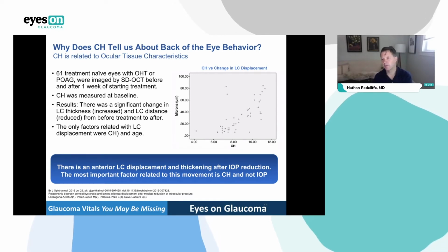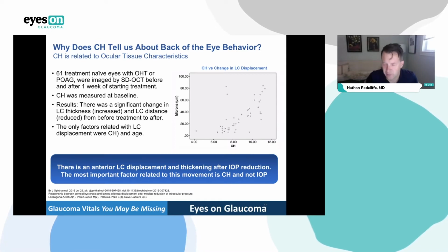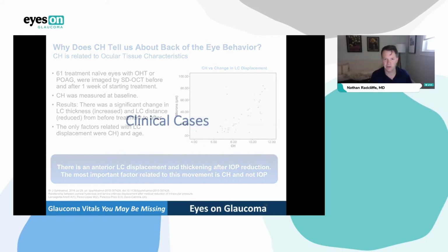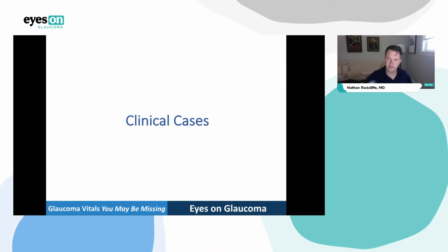And then think about what happens when you get older, you lose your hysteresis, it's now low, the shock absorber isn't working, the pressure goes up, but your hysteresis is low. Instead, the nerve can't cup in a physiologic manner, and you probably have retinal nerve fiber layer stress and damage across the lamina. So it's a healthy behavior for physiologic cupping to happen, like in young kids with a high hysteresis. And maybe when we get older and we lose that shock absorber capacity is when ganglion cells start getting damaged. All right, well, I have some cases here.